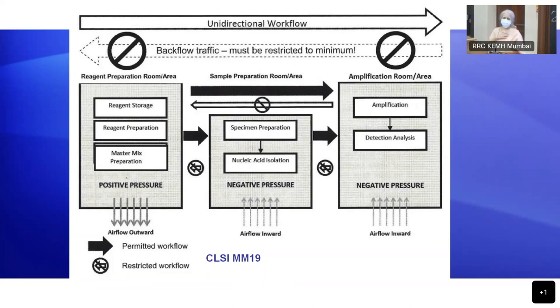I'm not saying no, but I think some people are extremely talented and extremely intelligent. But for a normal individual like me, I would like to have at least three areas for these three different activities, where the movement always has to be in one direction, never the other way around.